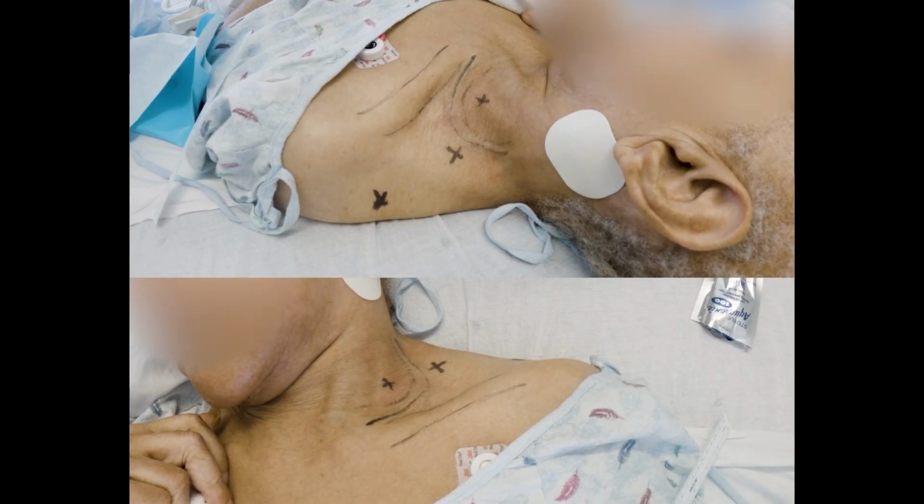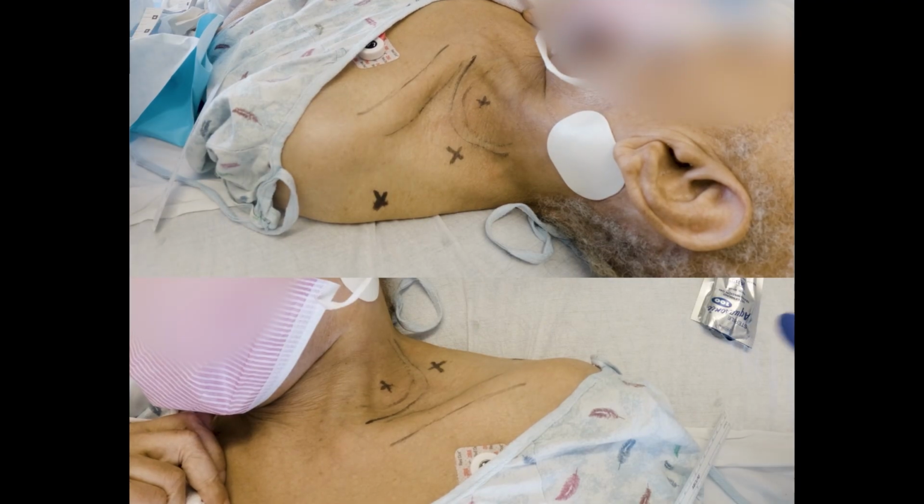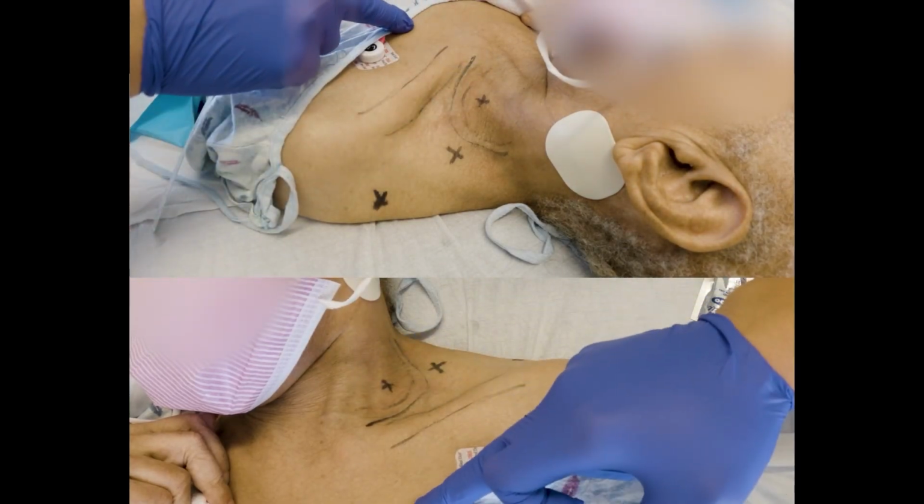Now, if her EKG and her P wave, which I saw on her 12 lead, had a very prominent P wave, we're not going to have to worry so much about the measurement. But let's do it now. Actually, yeah, because we're tunneling, we need to get a good clear measurement of our location. But this is a tricky one. We can't tunnel it out to here.